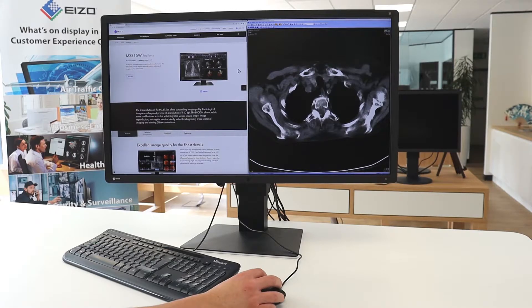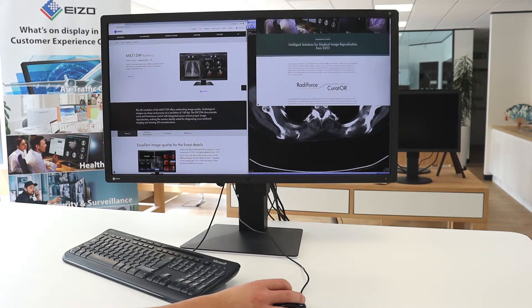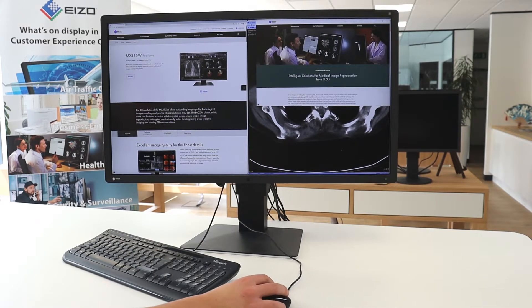Further to this, our hide and seek function enables you to easily hide the picture-in-picture window not currently in use and reopen it as needed by moving the mouse cursor to the edge of the screen. This eliminates the need for an extra monitor while still allowing quick and efficient viewing of reports or patient charts.